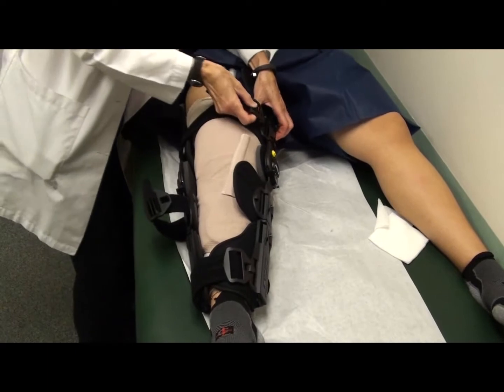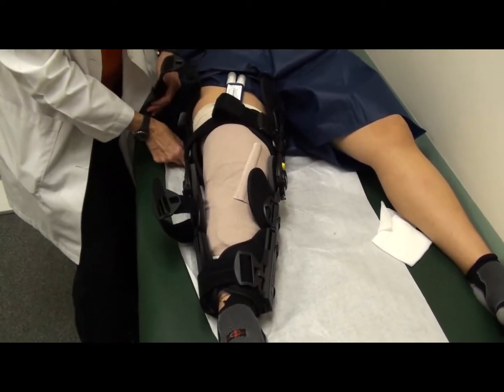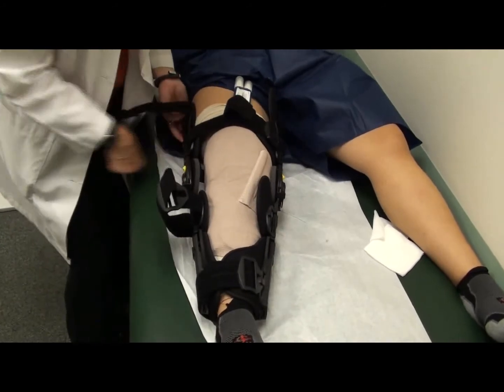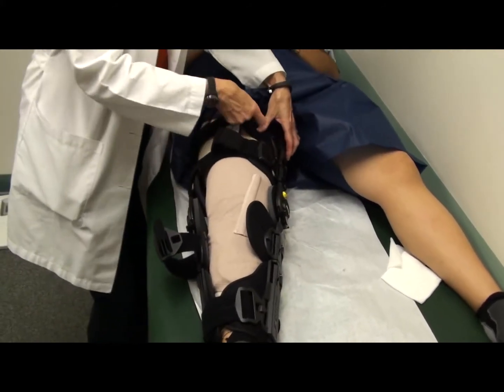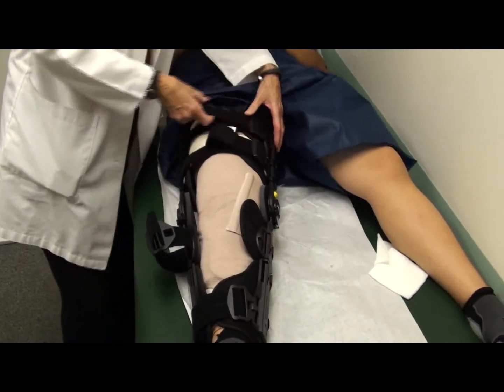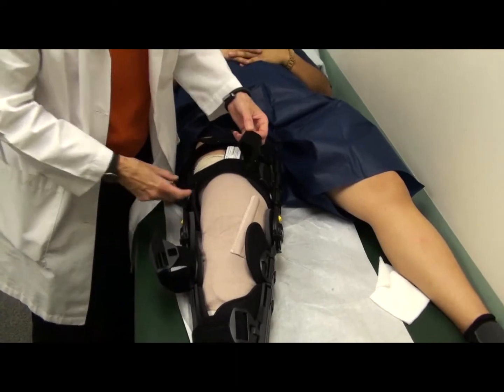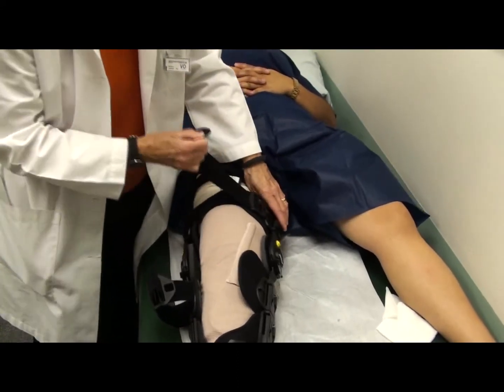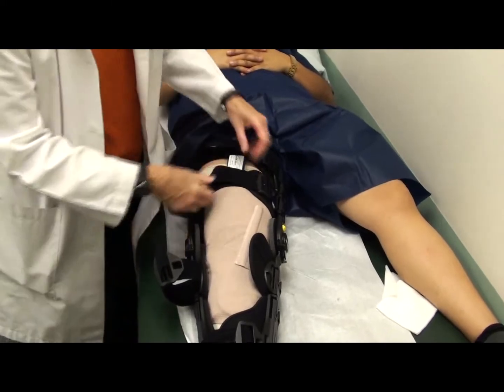Now remember, after you change the dressing, the brace may be a little bit loose, and I'll show you a trick on how to tighten that up. So we're going to hook all these back on. Well, this was pretty loose, so what are we going to do? How are we going to adjust that? Well, you might think, okay, I'm just going to pull here. You can just pull it tighter here, but sometimes you'll still have some slack behind.